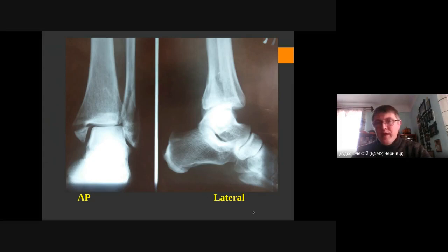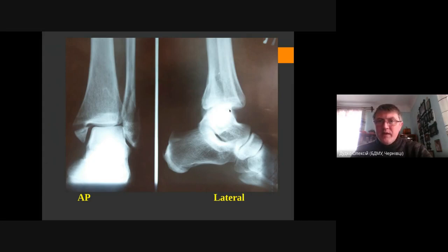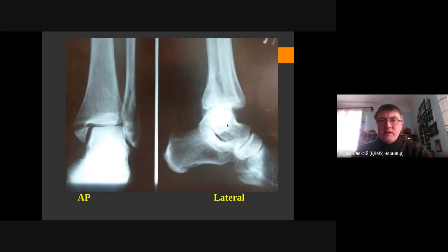Now let's go to the lateral view. Here we can see some other interesting findings. We should check the joint surface — we see the posterior part and we see that the talus is dislocated to the posterior part as well.